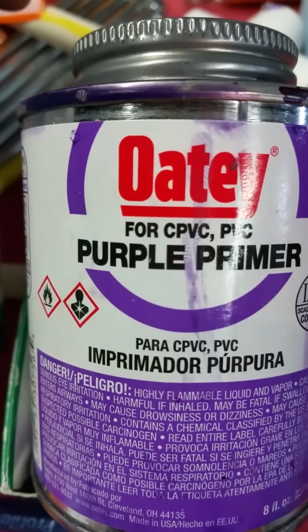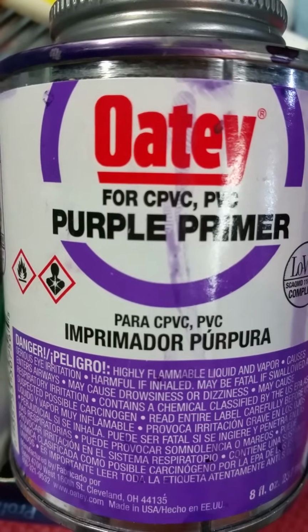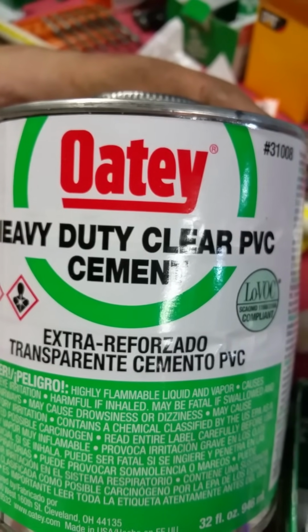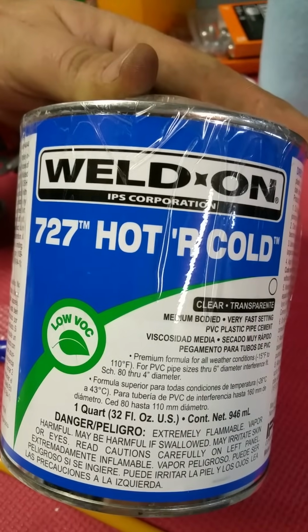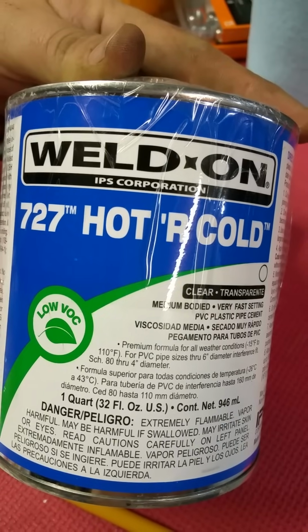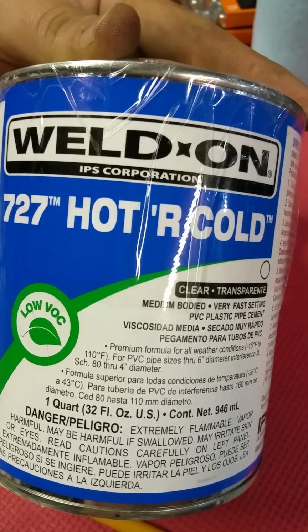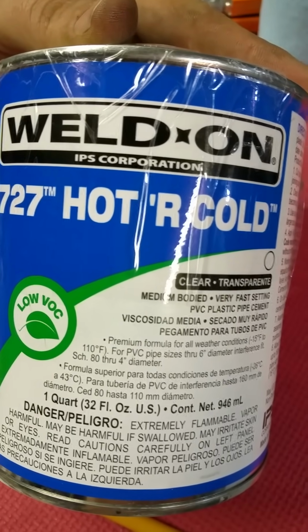We are going to be using the purple primer to go with the glue on our PVC, and this is the glue that we're using. We do have an alternate way that you can glue without primer, and I'll show you that in 1 minute. We have also had good success using this glue without primer, and it gives a good strong hold without any purple residue. We aren't using it right now because we're using up our other stuff and we're used to priming before we glue.